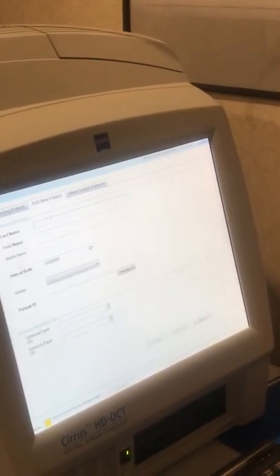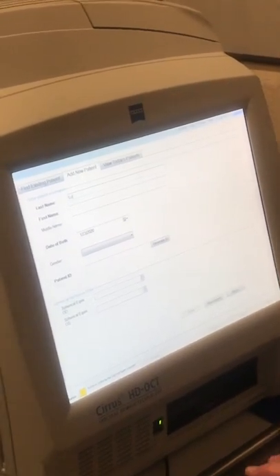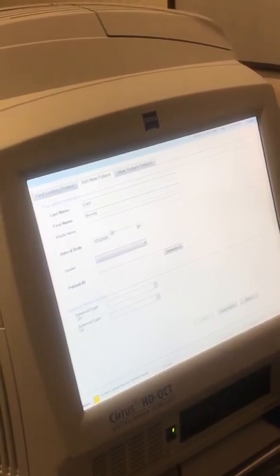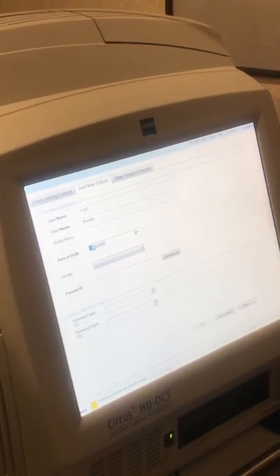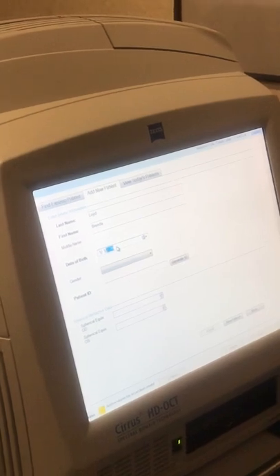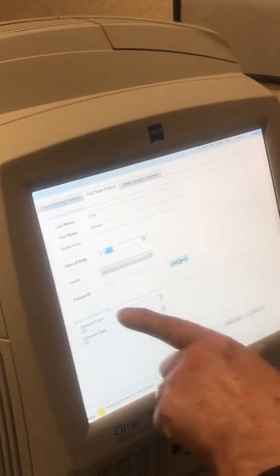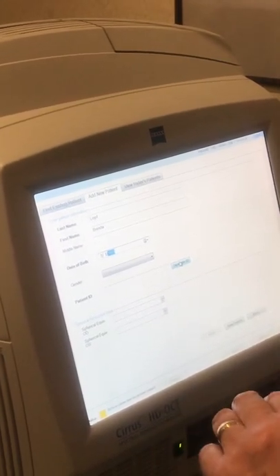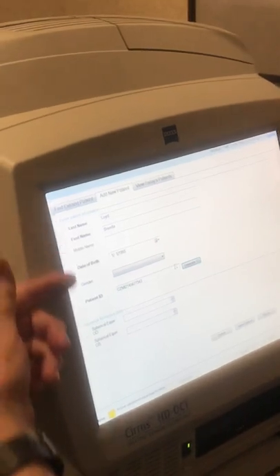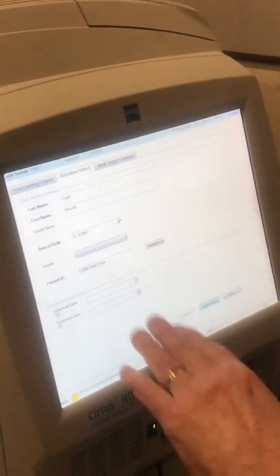We're going to add a new patient. Last name: Lloyd, L-O-Y-D. First name: Brenda. Date of birth: 1-1-55. For the ID number, usually they're social security numbers. You have to have one in here — there are four fields highlighted that have to be filled in, so I just usually generate an ID. That gets it done. Then you save that information.